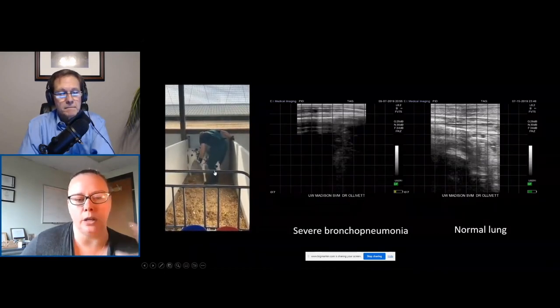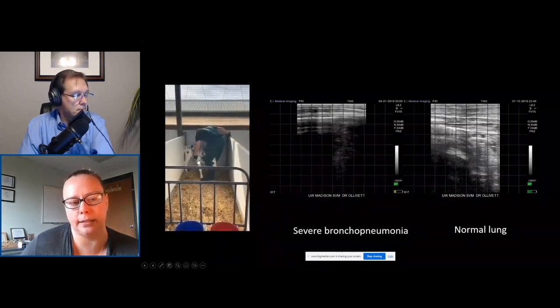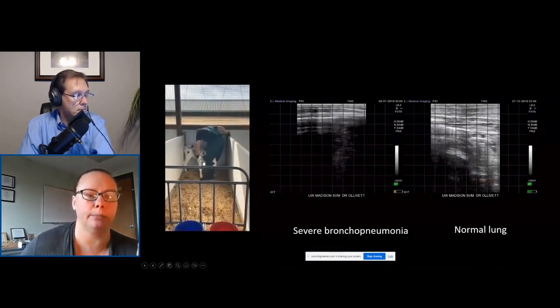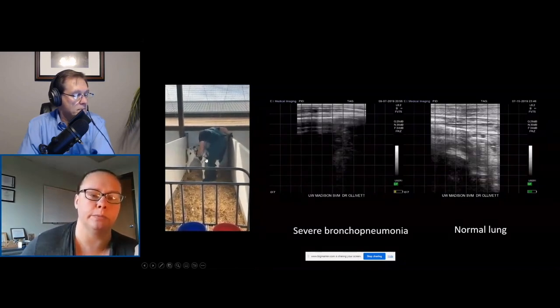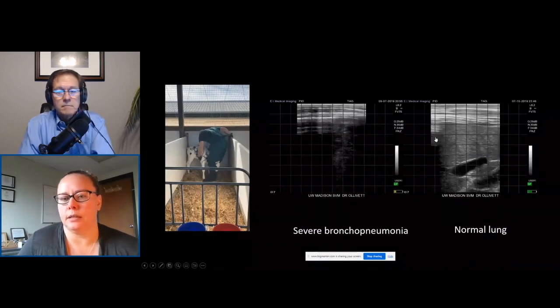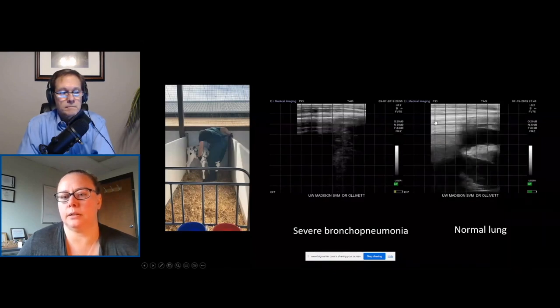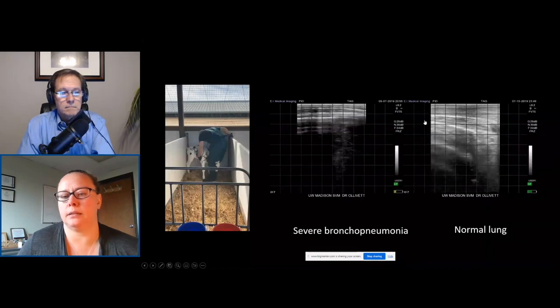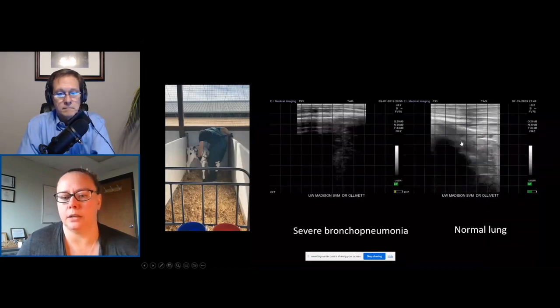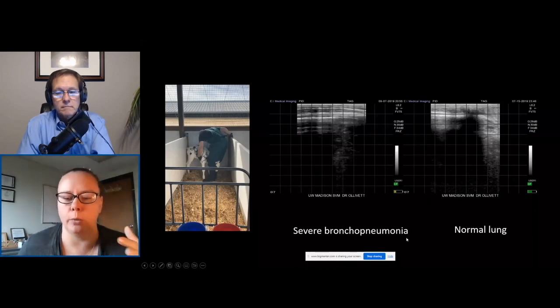It is possible. On an adult cow, we are not going to be able to get up to the first rib space by going behind the arm like that. We're going to have to come in front of the leg to see that rib space up front. So if I play this normal image again, I'll show you this is one rib space. This is probably the 6th rib space, this is the 5th, 4th, 3rd, 2nd, and 1st. So just by looking at the landmarks on that screen, we know where we are.